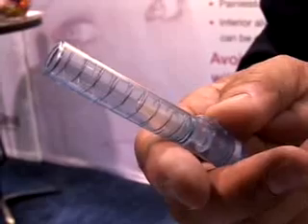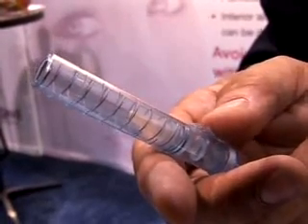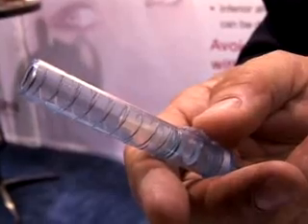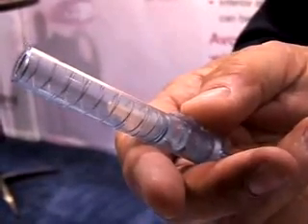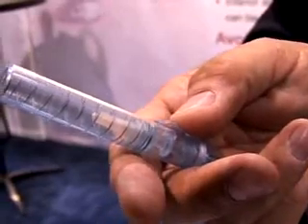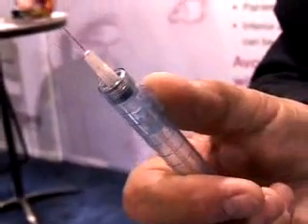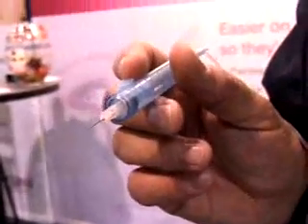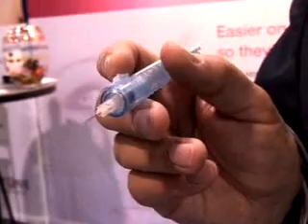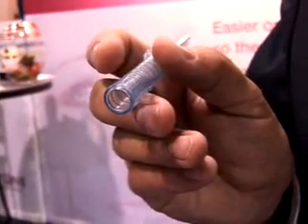As you can see, the luer lock needle is retracted into the cylinder. It's a spring-loaded system. It's very easy to project the needle. As a matter of fact, all that's necessary is for the thumb to lightly push the tab forward until it clicks into place. You can give the injection. After the injection is completed, you very lightly touch the back tab, and the needle retracts into the cylinder.